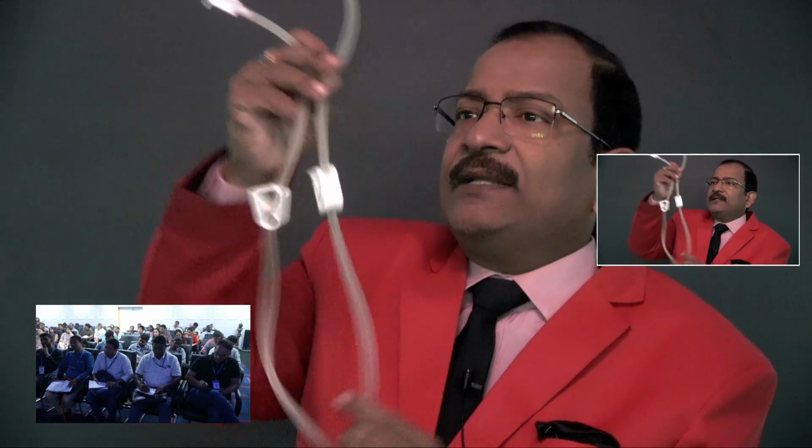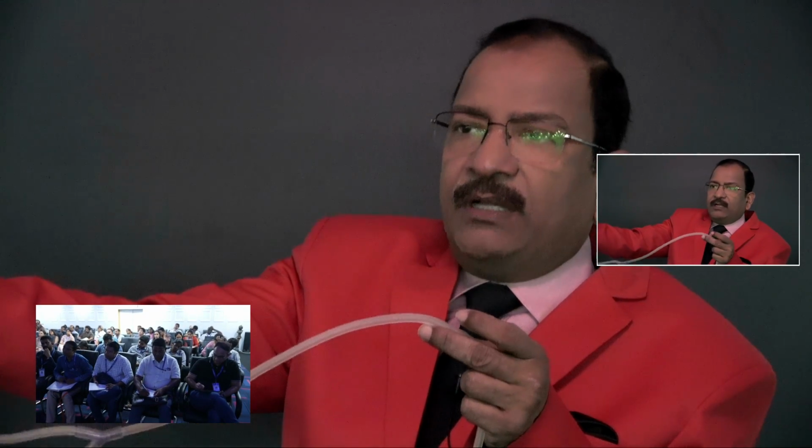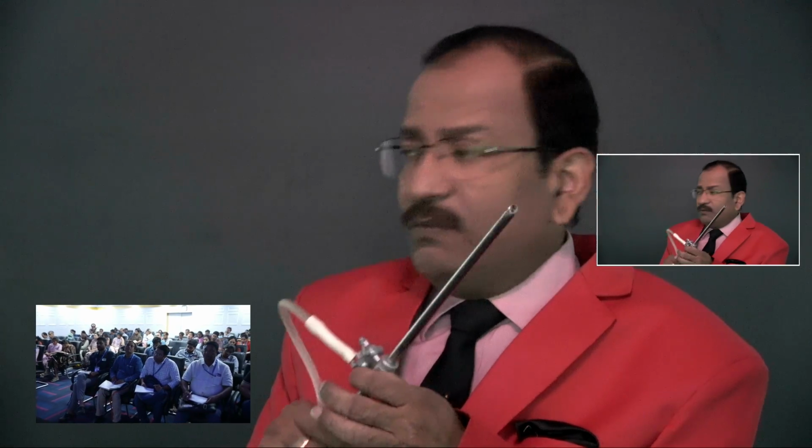This is the Y channel. And this end will go to the 2 bottles, and this end has a lever lock which you will attach to the tubing of the inner sheath. The inner sheath tubing, it will attach like this here. This is the tubing, it is attached. So with this Y channel, don't use just a simple IV set.